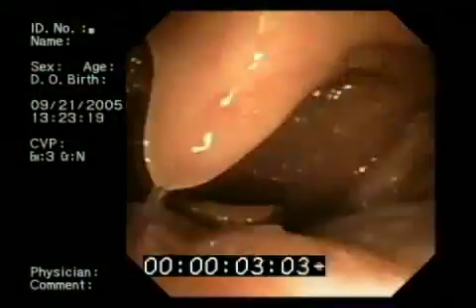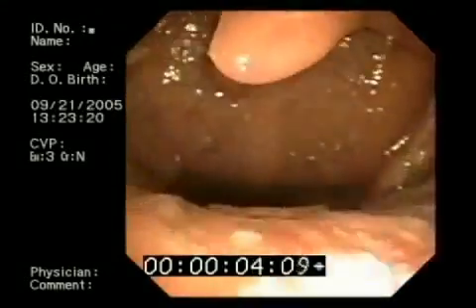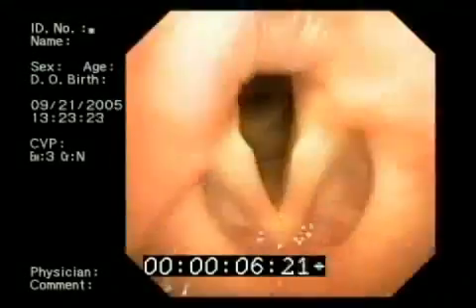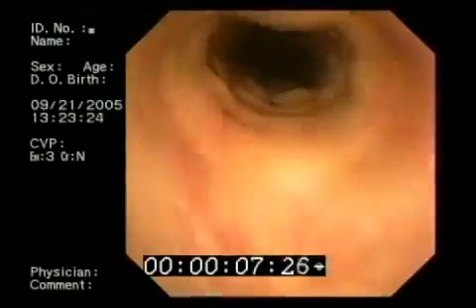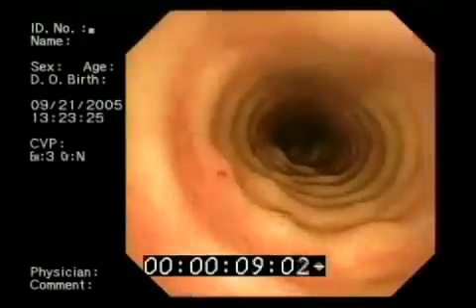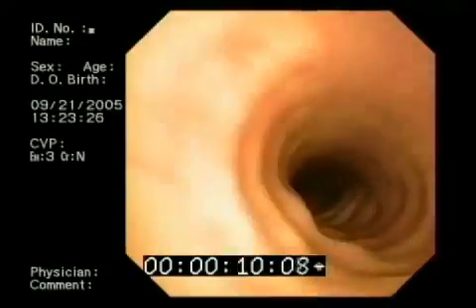In summary, awake fiber-optic intubation can be rapidly achieved with good topical anesthesia. Fiber-optic intubation is an invaluable alternate technique in the management of the difficult airway, and it should be mastered by all airway practitioners.